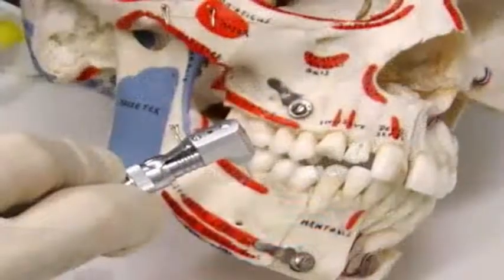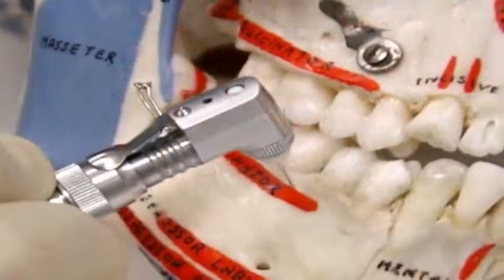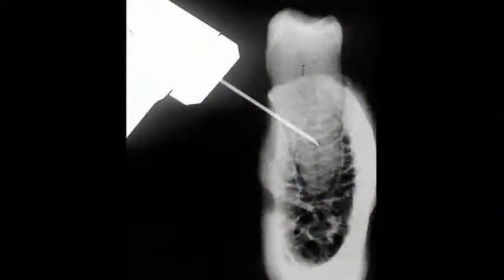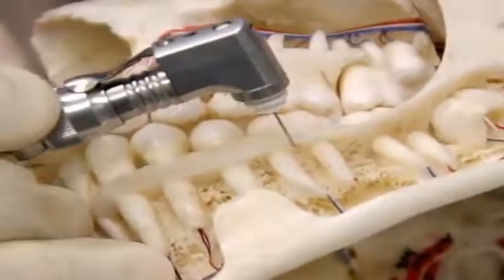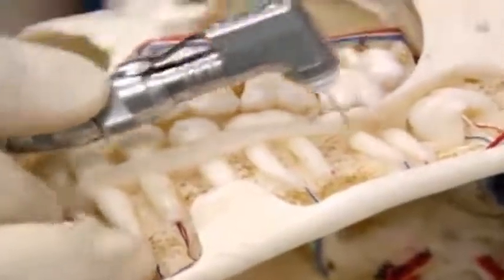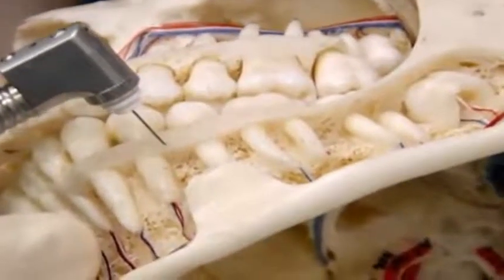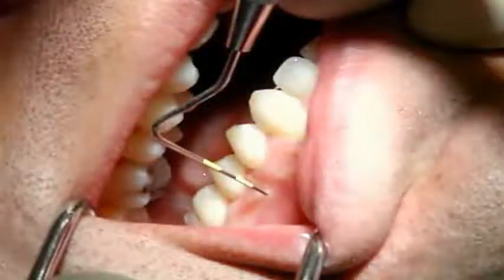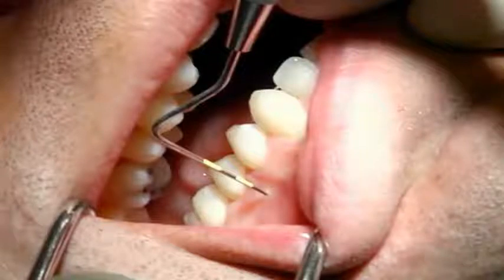If the premolar is to be anesthetized, the perforator is positioned at approximately a 45-degree angle to the bone. After penetration, the perforator tip drops into the medullary space. Note that on the mandible, the cortical bone is dense and increases in thickness to the posterior. This is why the posterior mandible is difficult to penetrate with the perforator. This shows the location of penetration, which is in the interradicular space with the attached gingiva, slightly apical to the cervical margins of the crowns.